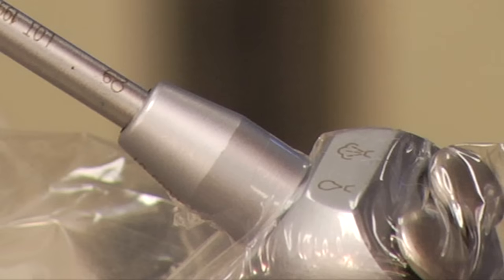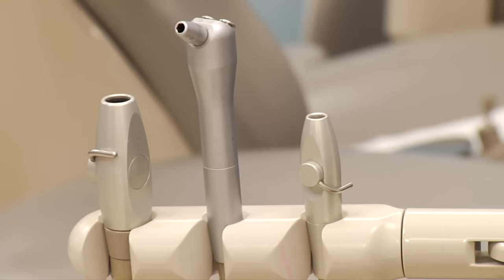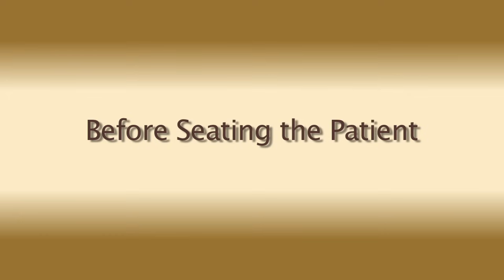Prior to practicing suctioning on a co-student, the correct OSHA-approved 2-wipe disinfection method must be performed on the dental unit. If you are not sure of the correct method of disinfection of a dental unit, please review the opening wipe and barrier video. You do not need to disinfect the utility cart or any of its attachments.